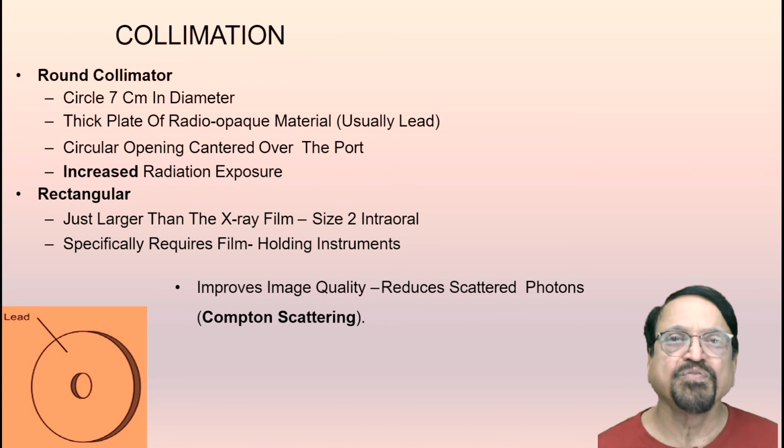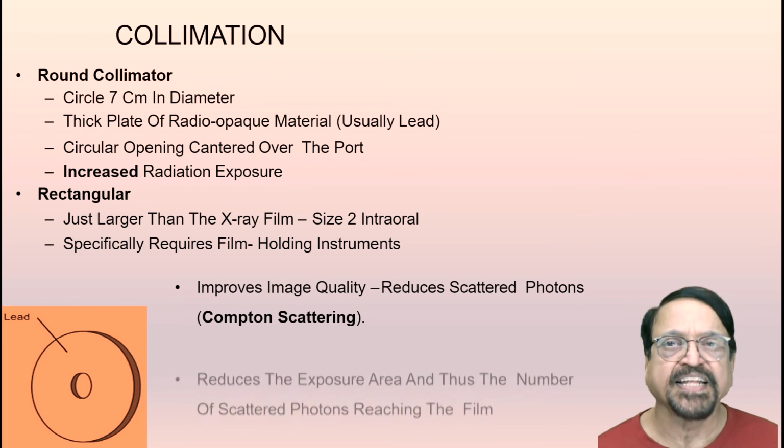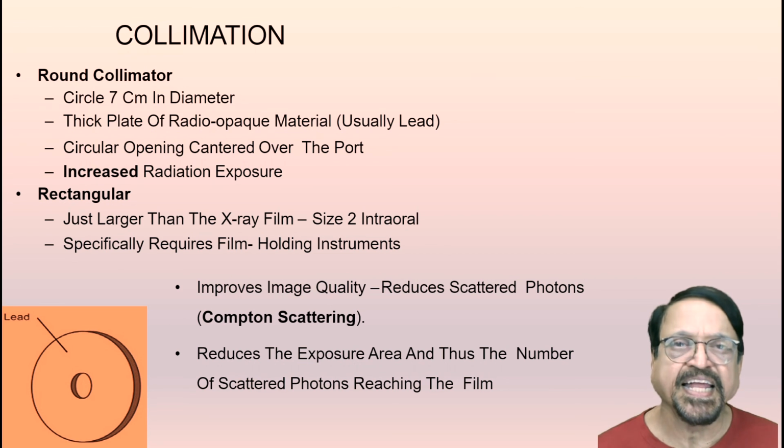Then it improves quality and sharpness, and reduces scatter radiation, that is Compton scattering. We have already got different videos on that. It reduces the exposure area and thus the number of scattered photons reaching the film.